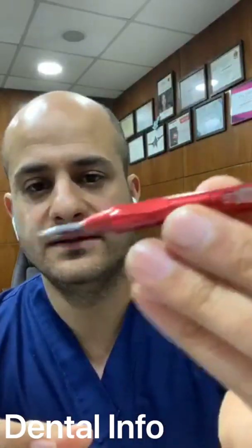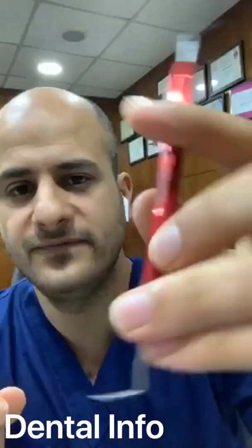Fast Fill, okay. It's a question reply. Yes, we have here a question about fitting the plugger before. Okay, of course. It's better to fit your plugger because we have different sizes. For example, this stainless steel tip is size 75. So always you have to fit everything before you use it, to avoid any surprises.